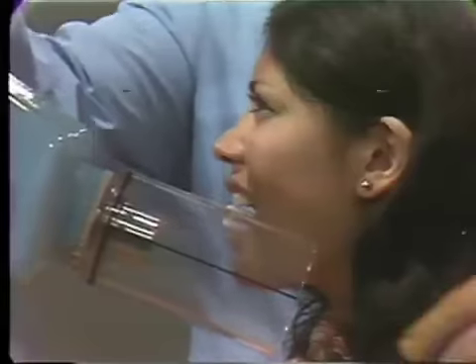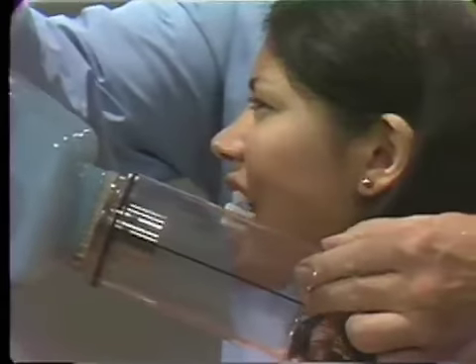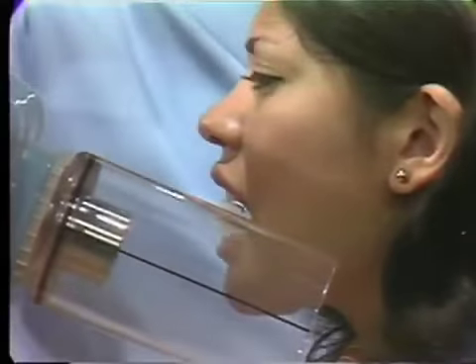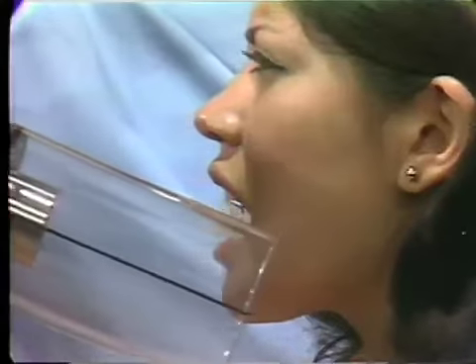Next, we want to determine the vertical angulation. So I want to orient the head of the X-ray machine, the cone of the X-ray machine, so it is parallel with the top edge of the block, as you see it now. This has provided us with the proper vertical angulation. What number this is, I don't know. I couldn't care less. Next, we want to determine the horizontal angulation.